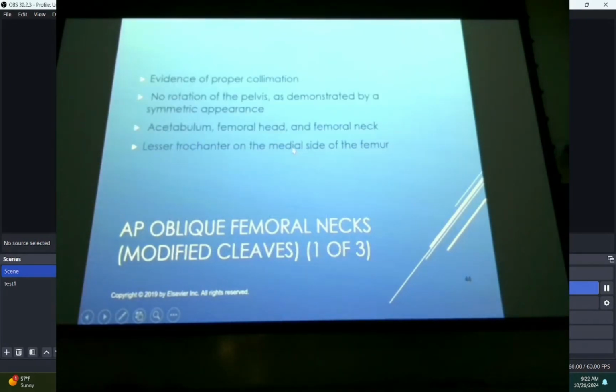All right. So you got your AP, and we can do a bilateral lateral hip. Okay, some people will refer to it as bilateral frog leg. And so what I want you to do first is it's kind of rare that they put this in the book in this order, but on page 400, you see the positioning for this, but it comes with a 40-degree cephalic angulation.